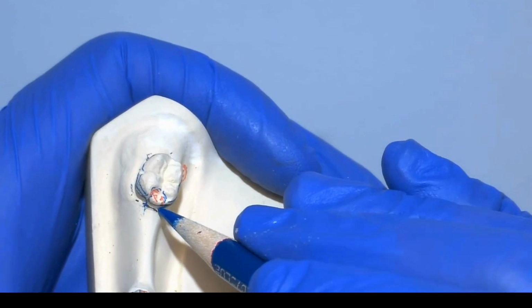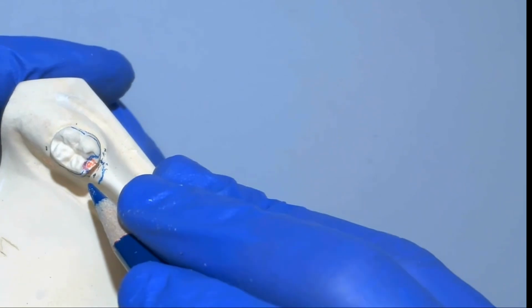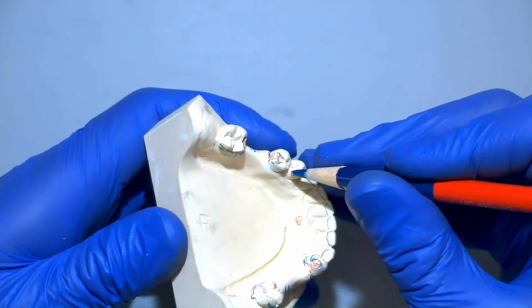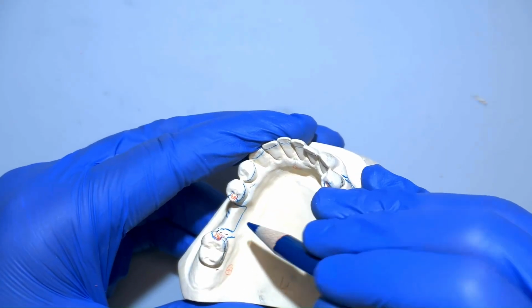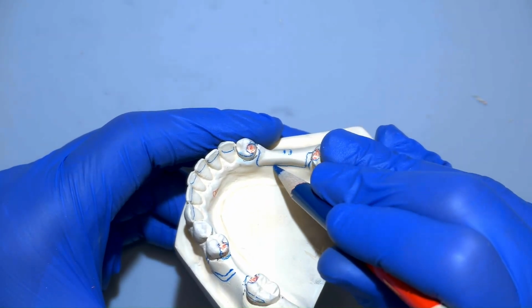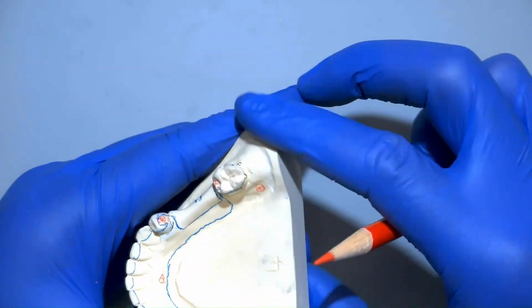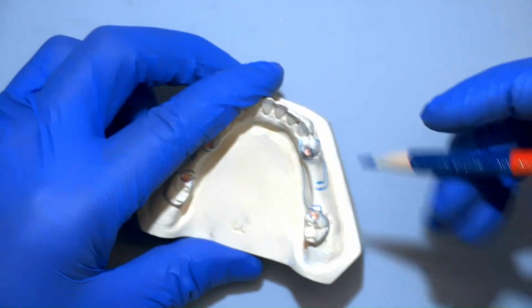The same goes for the cast circumferential clasps as we drop down from the guide plate. Now let's start the lingual plate going above the height of contour on the premolar and then from one proximal contact to the other on the anterior teeth until we make our way over to the other rest on the other side. To make our finish line, we're going to connect the adjacent minor connectors on the insides of those edentulous spaces. Now we'll connect the two remaining lines of the two minor connectors to finish the major connector. To complete the outline of the lattice, we're going to connect both sides of the eye-bar origins to the guide plates like this.